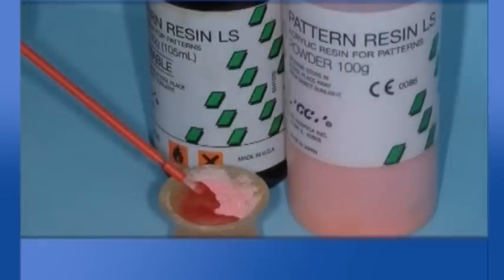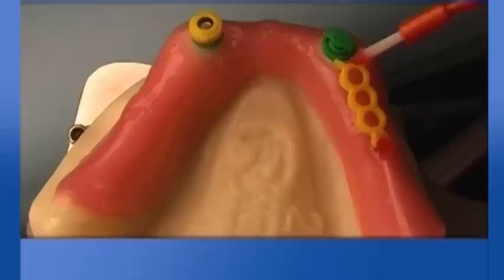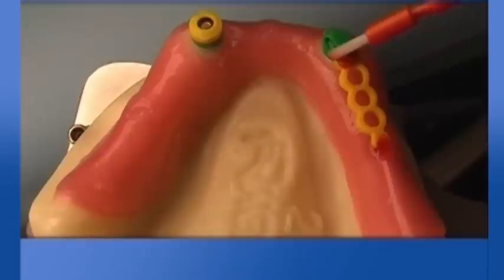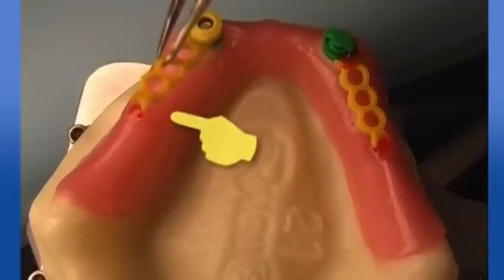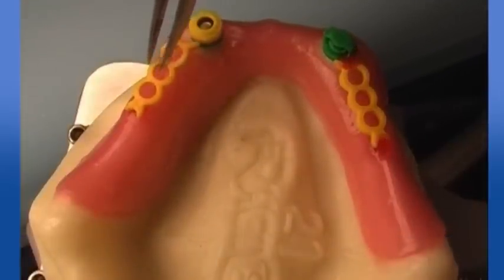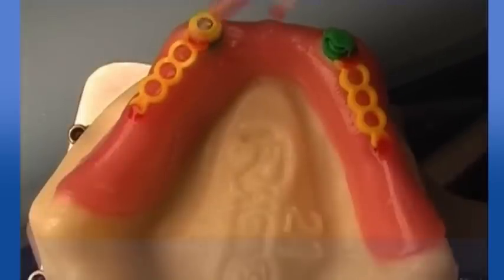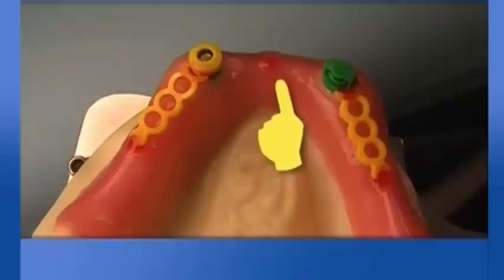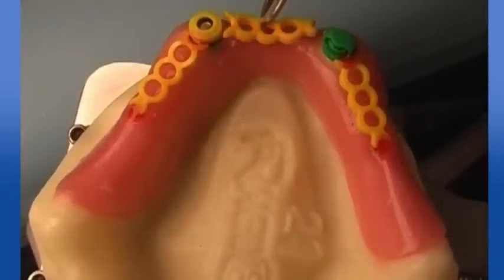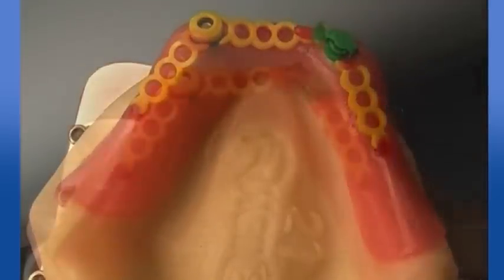Link by pattern resin small sections of castable components in order to avoid retraction. Let the resin cure and connect the whole reinforcement surface. Instead of using too much resin and to ensure as much passive connection as possible, use extra leftovers of castable parts.